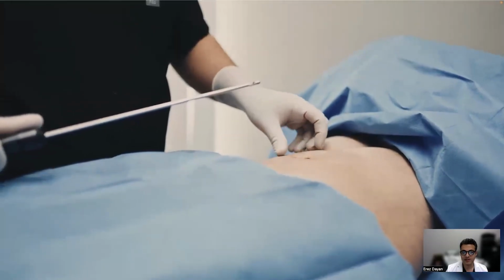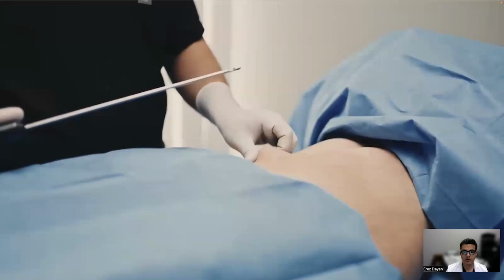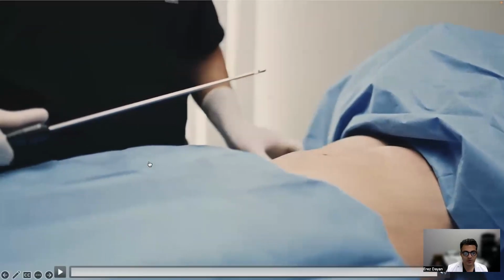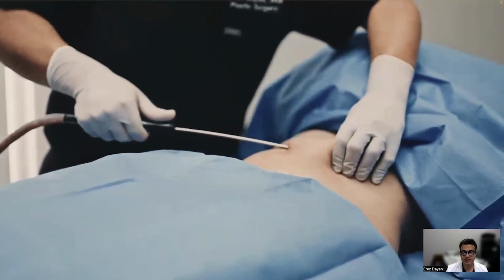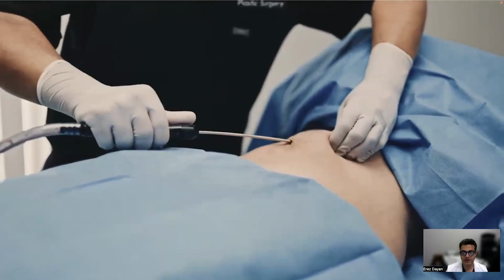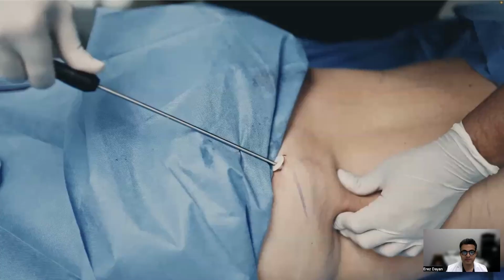So we do a skin pinch after and see where the area of adiposity is, where we want to treat. See if there's any area where we over-suctioned, where there may be a contour issue. And in those cases, either you liposuction more around those areas, or you can take some fat and equalize it by either injecting it or just shifting it over to fill those areas.